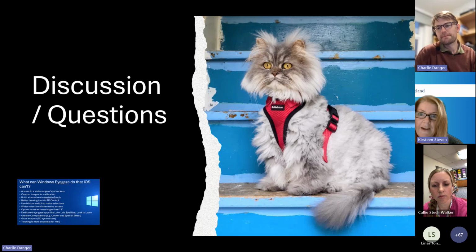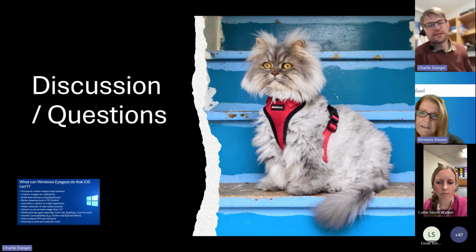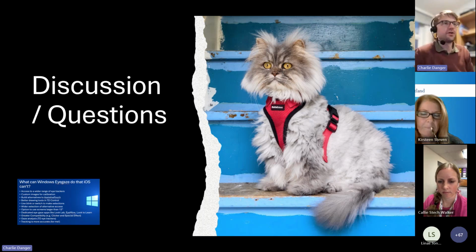Somebody else made a comment there about not wearing glasses, that could be a barrier for many AAC users as well, and that your head control and some of the barriers that some AAC users may have, you might not have had that as part of a fair test. Exactly. I've got very static head control.